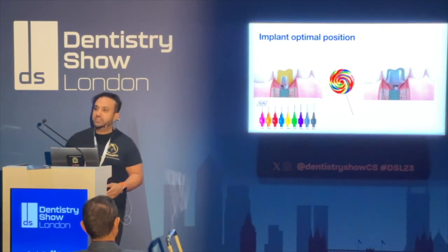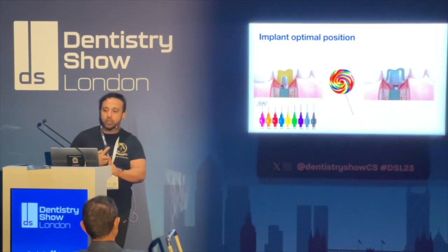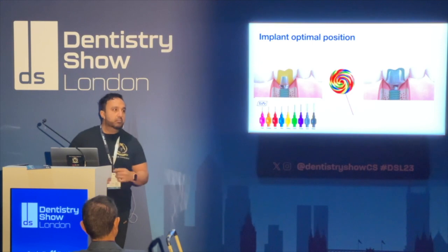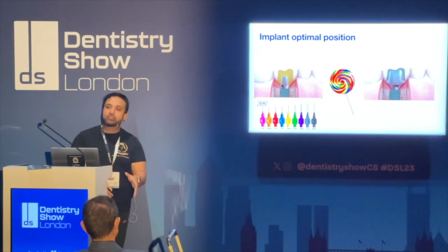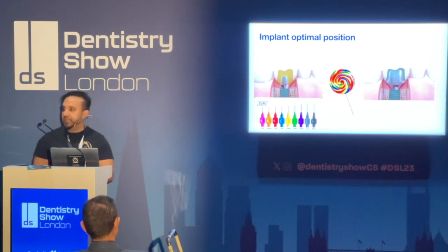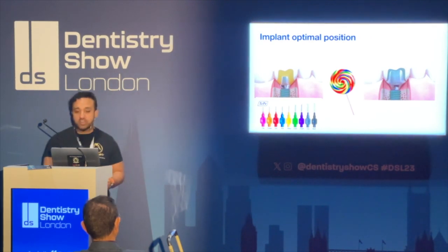So what you've got to tell your patients, they're going to be annoyed, there's going to be food packing, it's going to be needing to be TP 3 times a day. So what we decided, or what the industry decided, we created Atlantis abutments. But you will generally find the problem of molar implants with bounded natural teeth is that you will get more food packing in between. So again, another conversation that you need to have with your patients about when you're restoring your back tooth implants. And they'll be using large TP brushes for a long time. They need more maintenance than normal teeth.